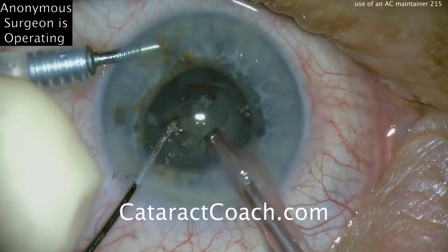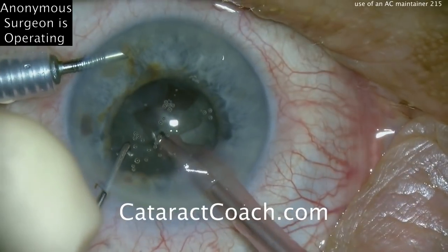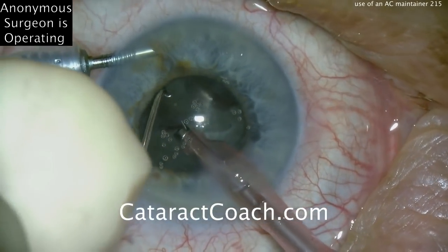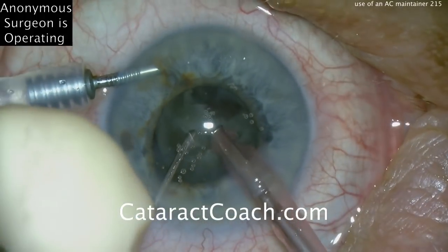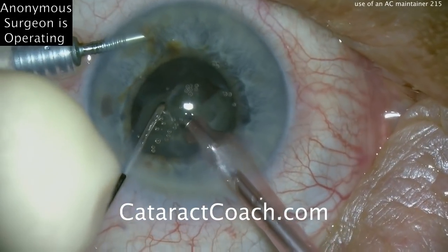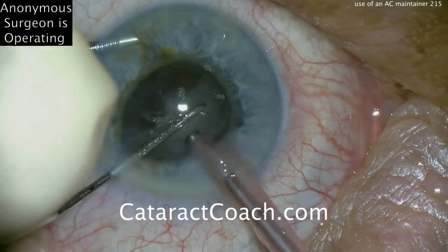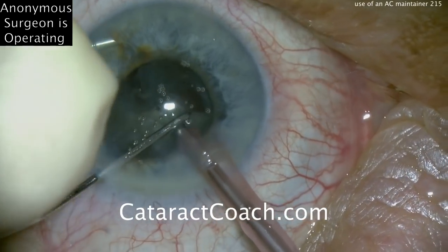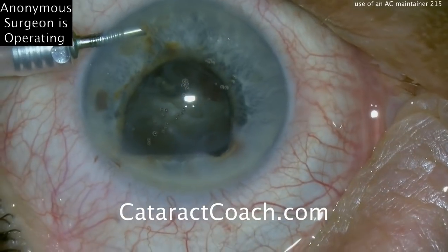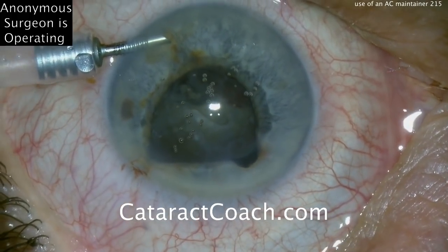We're speeding up the video, so it's going faster than normal — it's probably double real-time. One important thing here is the surgeon takes time to be careful at every step. When you're learning, don't look at the clock. It doesn't matter if the surgery takes an extra one, two, or even ten minutes. What matters is having control during the procedure and doing a safe procedure for the patient. In your first 500 or 1,000 cases, don't worry about speed — worry about efficiency and control.